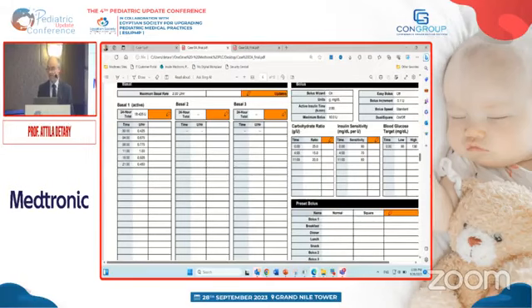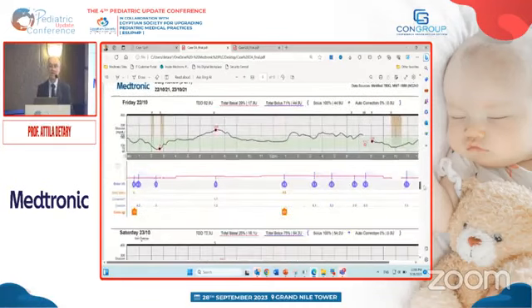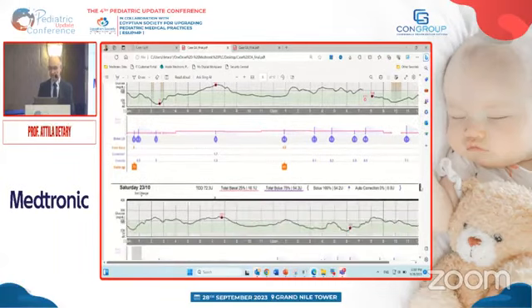So this is the report where you can check the settings, and then the daily reports come. So here you see every day one by one. So if you want to deep dive into the days and discuss it with the patient, don't forget that this is not only for you. So this is for you to analyze the data. However, you can discuss sometimes of the days, the mistakes with the patient, and show this report to the patient as well. So these days are showing the manual mode.